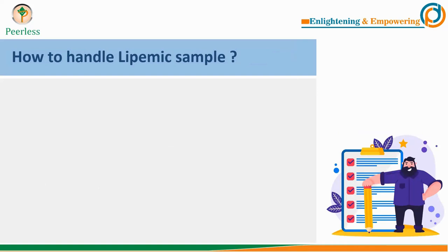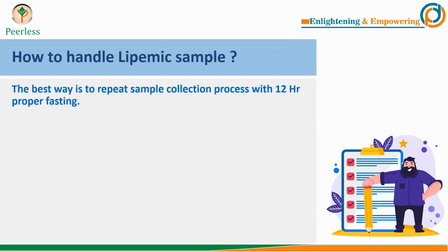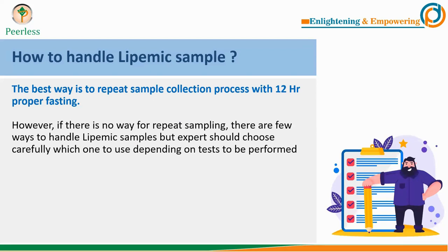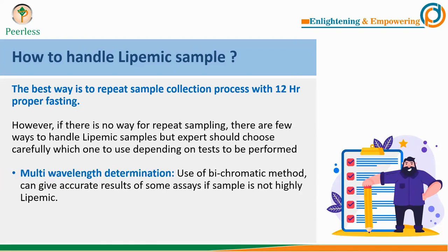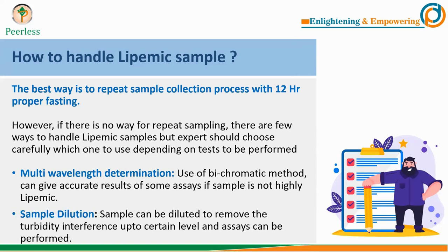The best way to handle a lipemic sample is to repeat the sample collection process once the patient has completed 12 hours of proper fasting. However, if repeat sampling is absolutely not possible, you can follow a few steps. First, you can perform the test using a multi-wavelength or bichromatic method if the sample is not highly lipemic. Second, you can perform sample dilution to reduce the turbidity interference, and up to a certain level the assay can be performed by multiplying the result by the dilution factor.